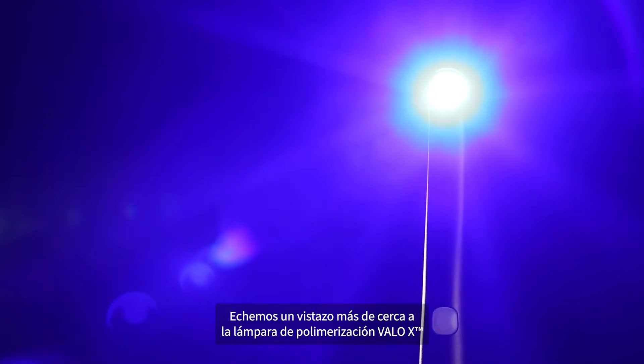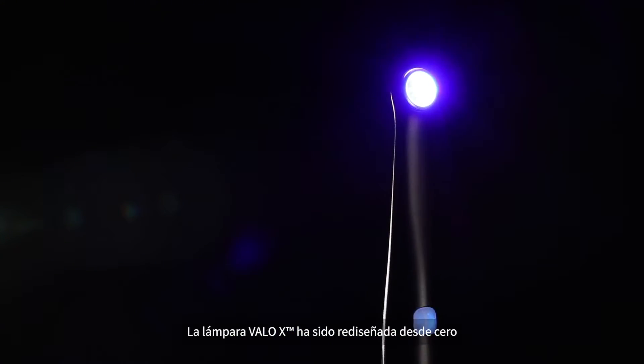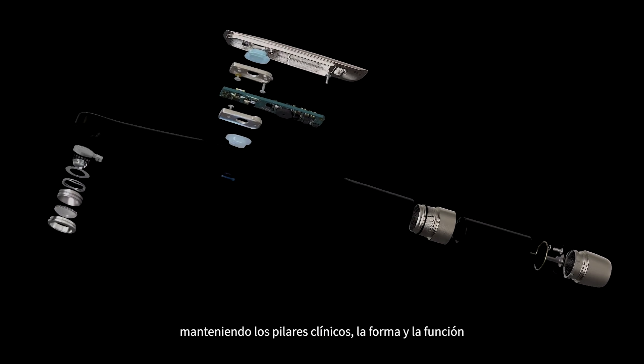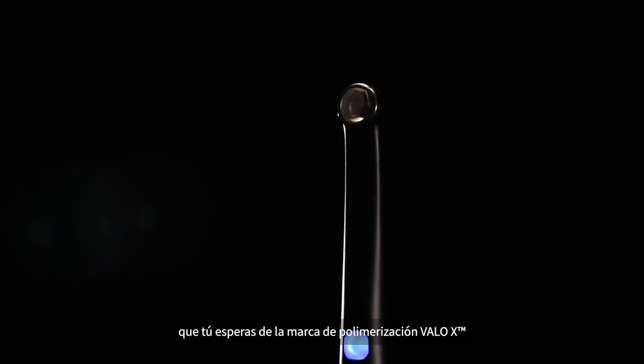Let's take a closer look at the VALO X Curing Light itself. The VALO X Light was redesigned from the ground up while holding true to the clinical cornerstones, form and function you've come to expect from the VALO X Curing Light brand.